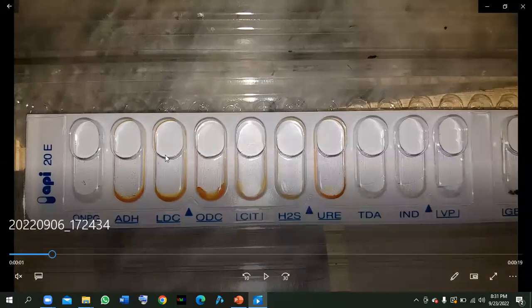Now I want to tell you that these inoculating regions have two regions. We will discuss ADH. Just look here, there is a small line below the ADH. Look at the citrate as well. It also has a line, but these lines are moved to the upper portion.